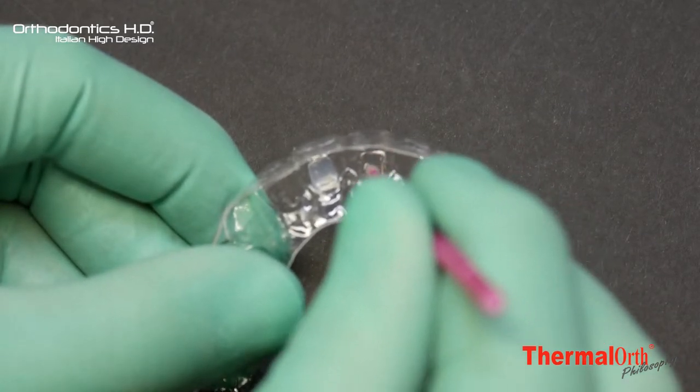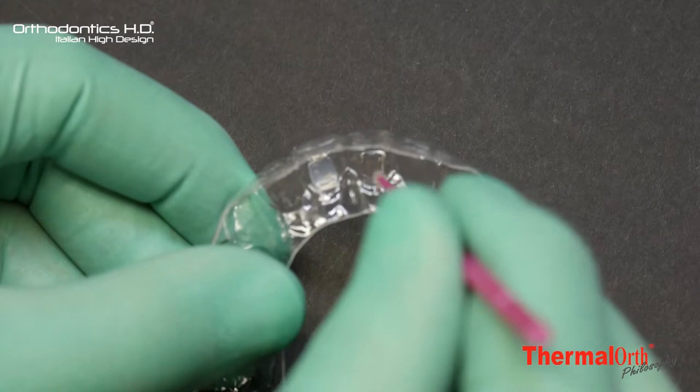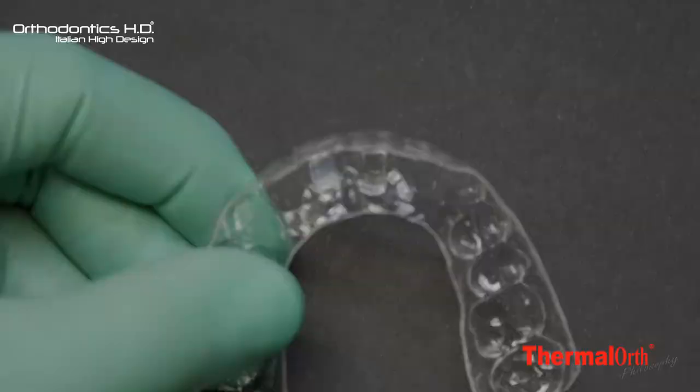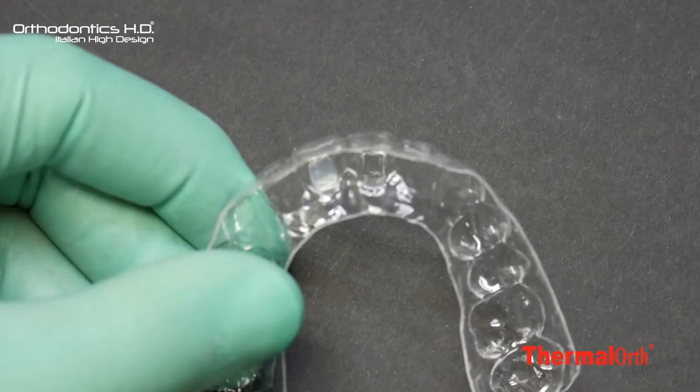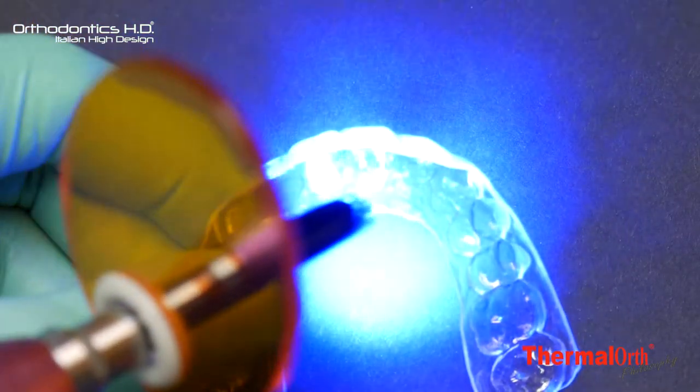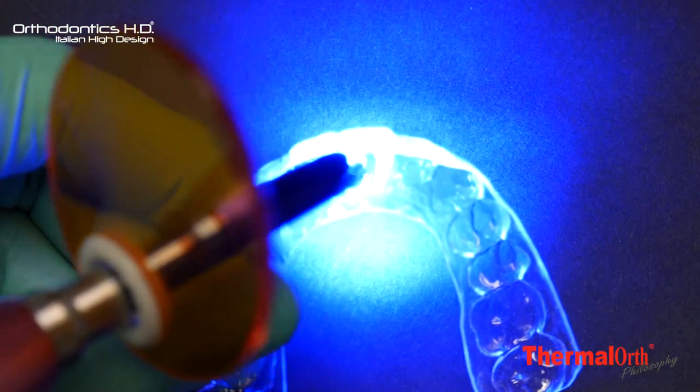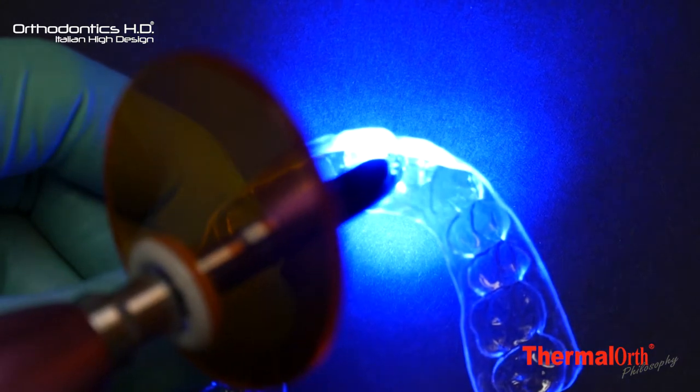insert a quantity of resin such as to avoid the unnecessary removal into the space obtained by the thermoforming operation and activate the light curing process by using the light curing light.